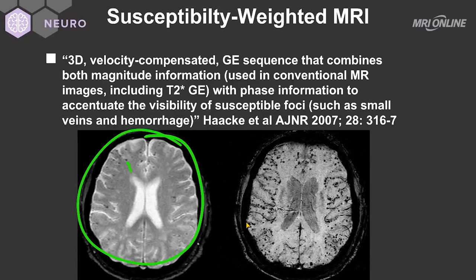On the left side we have a gradient echo scan showing many small black dots of hemorrhage — in this case hemosiderin, because there is no edema around them. On the exact same slice using susceptibility weighted imaging, we see so many more foci of hemosiderin. Although gradient echo technique used to be our best tool for detecting hemorrhage, we have now replaced that with susceptibility weighted imaging, which is far superior. Thank you to Mark Haacke.